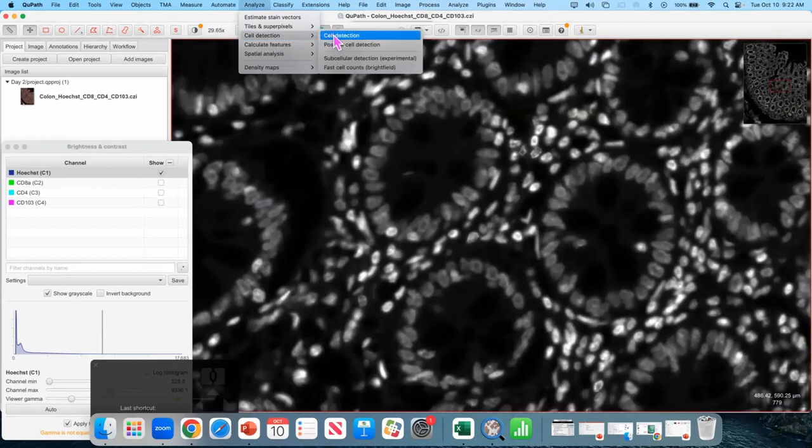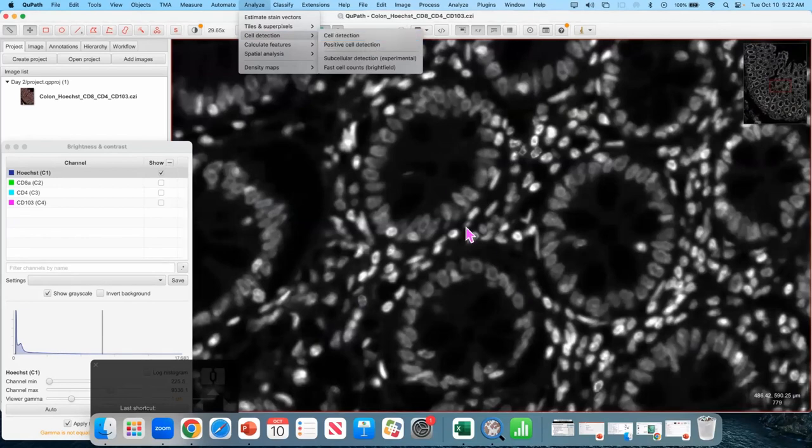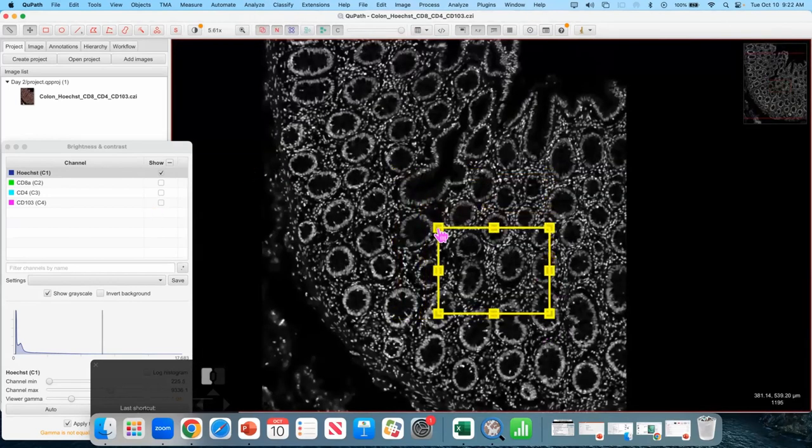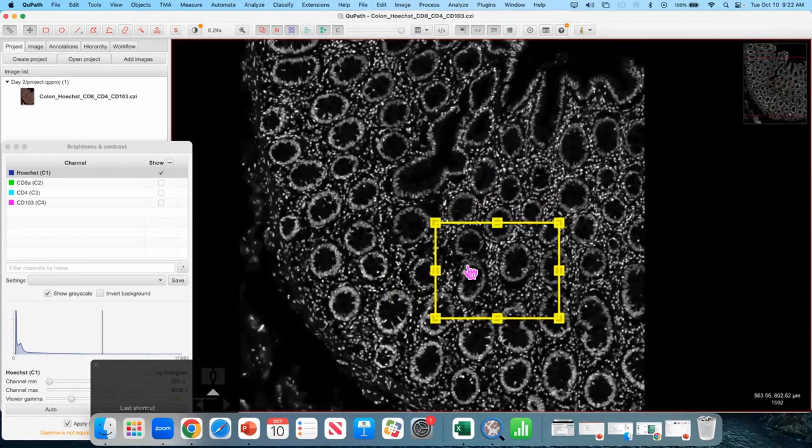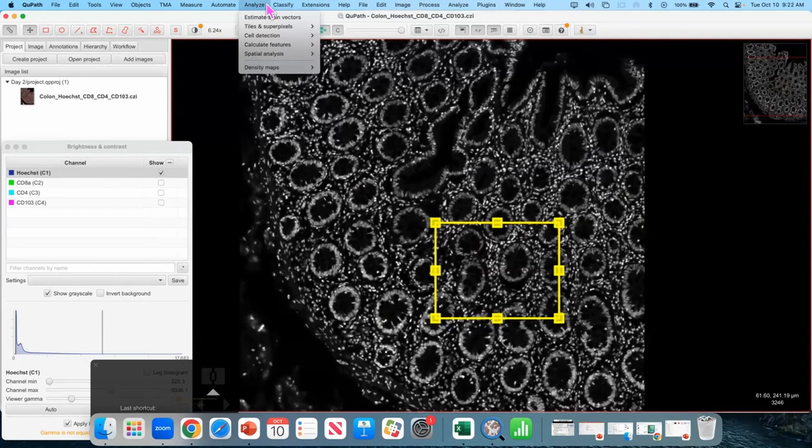Analyze. Cell detection. The word you can add. I type in cell detection. Great. And I started by drawing a small-ish rectangle. That's actually probably too big anyway. But you definitely want a rectangle like that. A couple of these crypts. And a couple of the villi. And a couple of the surrounding region.